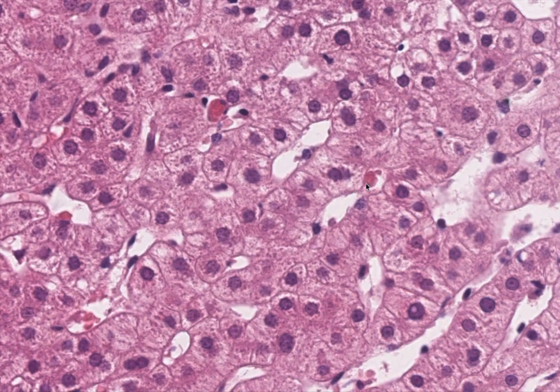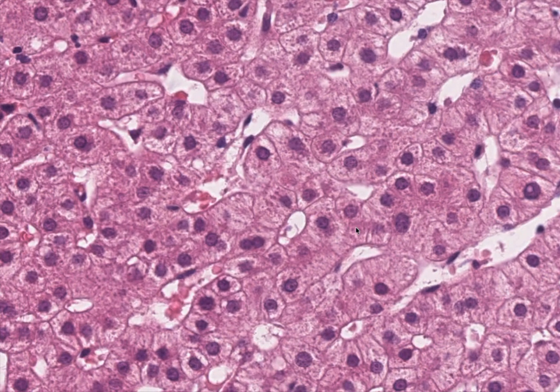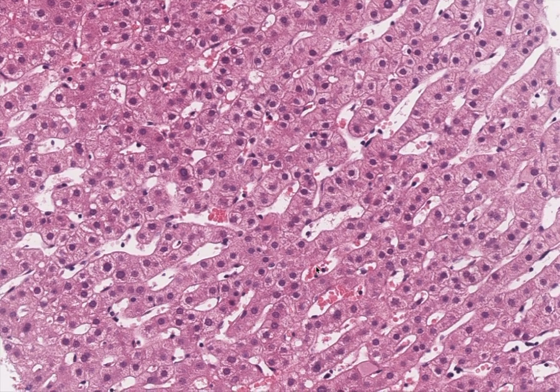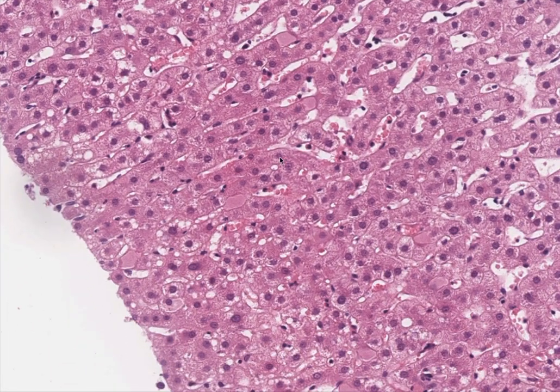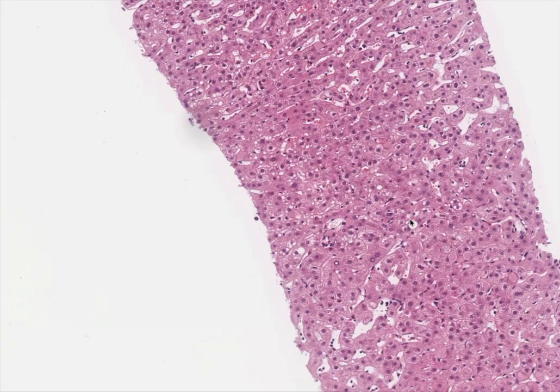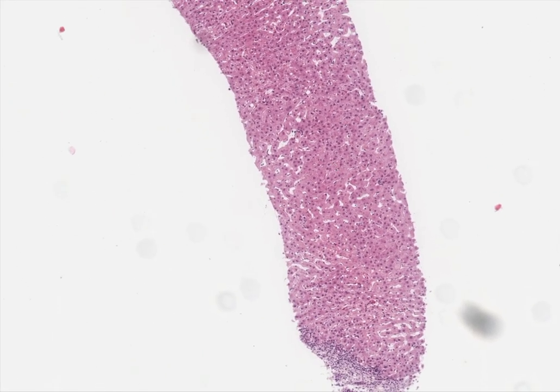I was thinking this might be a Councilman body, where we have a bit of cell death, but this probably looks like it's more in the sinusoid, so it might just be clumped red cells. Here's another hepatitis B inclusion, and here and here. So I'm feeling more certain now that this is in fact hepatitis B, and there is chronic active hepatitis with bridging fibrosis.